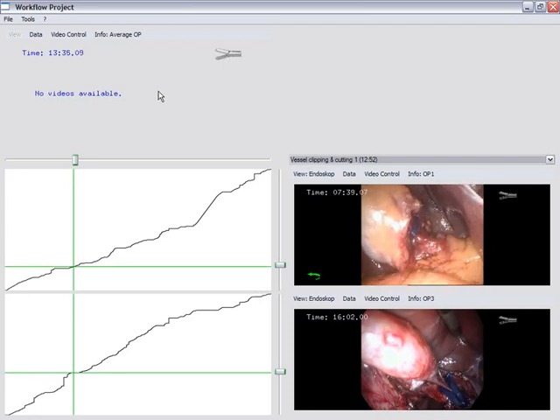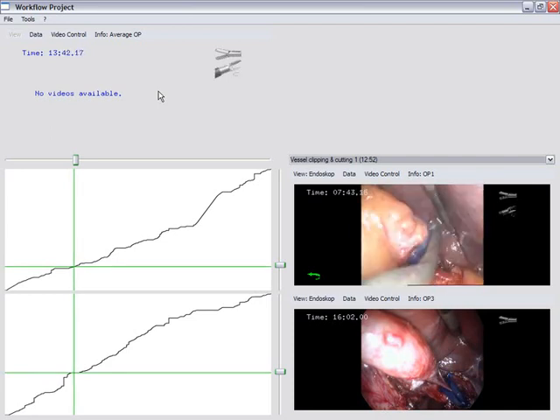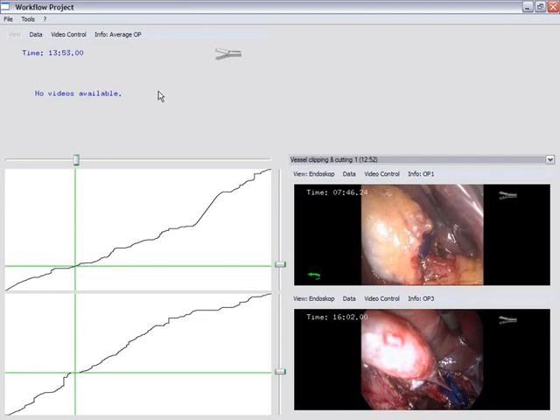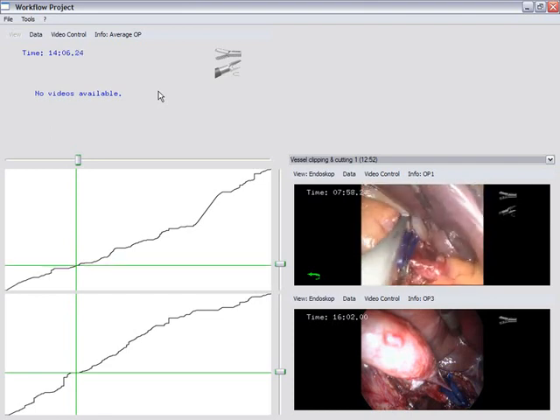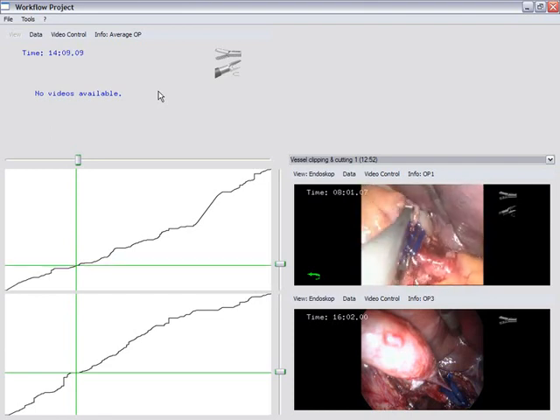Two different clipping techniques are demonstrated by the surgeon. The upper video shows how an artery is clipped 3 times before it is cut. In the lower video, the vessel is clipped only once. The lower video waits until the upper video is finished with the clipping.